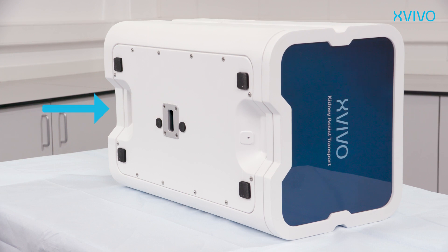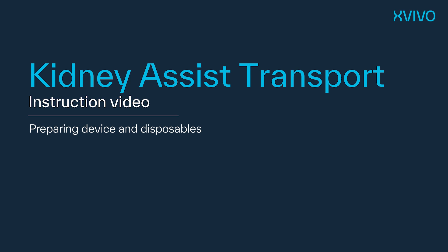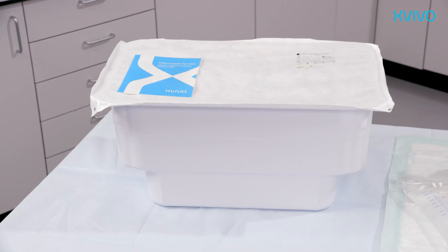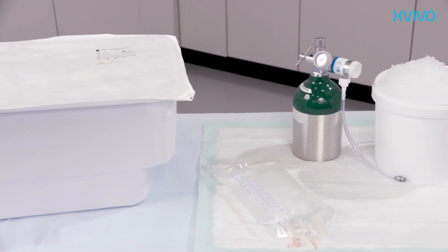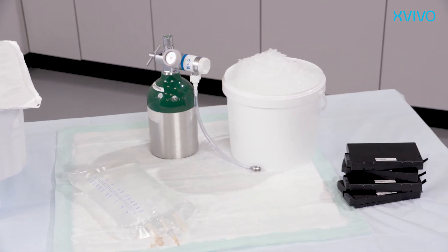At this side you will find a receptacle for the external power supply which allows you to run the machine on AC power. To run a perfusion procedure with the Kidney Assist Transport you will need one disposable kit, one liter of certified machine perfusion solution, a compatible oxygen cylinder, crushed ice, and four fully charged batteries.